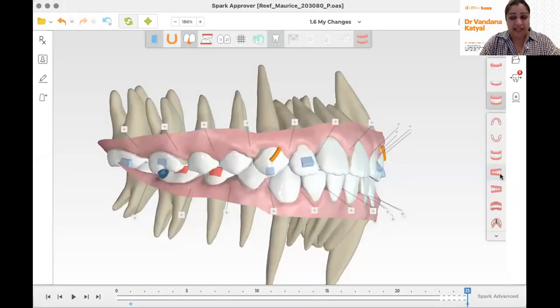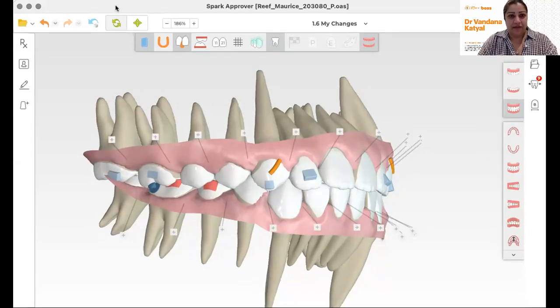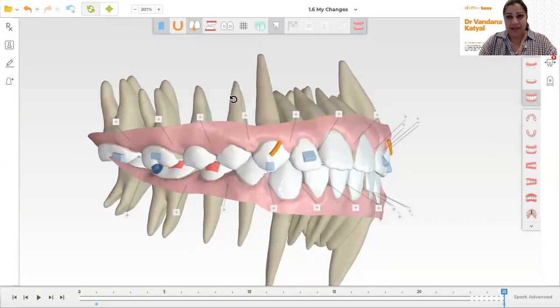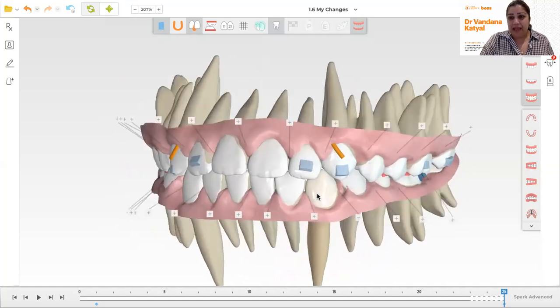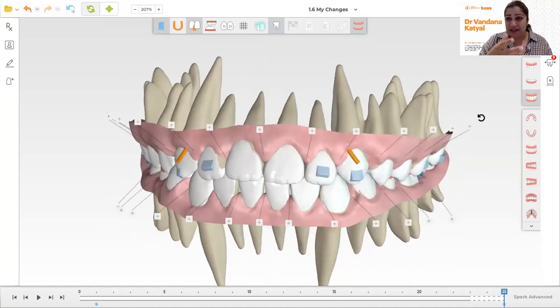Hi guys, welcome. Today I wanted to share a quick demonstration of a new aligner system I use called Spark. Spark is by Ormco and I'd like to share what the software is like, what my experience is like, and I'm going to make this as big as I can for you. I think this is an aligner system I've been really loving. I've swapped a lot of my patients from Invisalign to Spark and I'm finding the software is really user friendly.